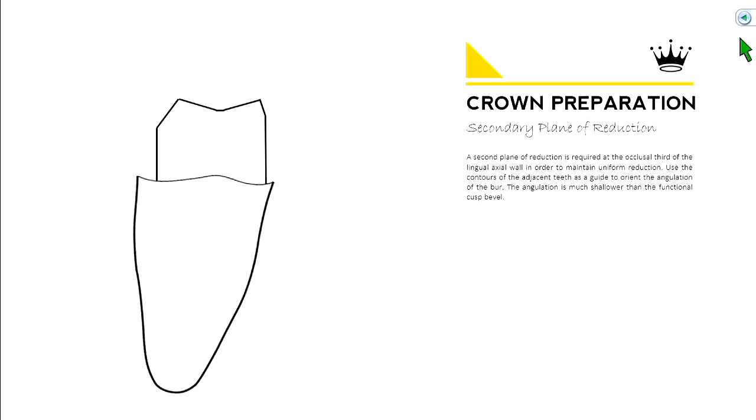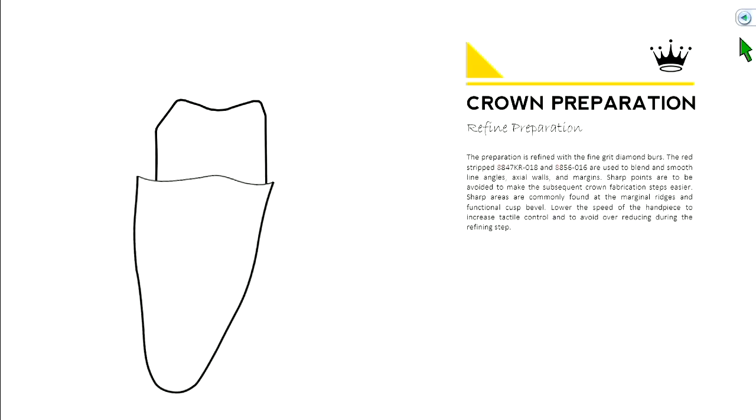That's the general outline of the prep. You'll see all the sharp angles and points — we're going to refine and smooth those out. We don't want anything sharp in our preparation. At the end of the day, that's what a crown prep should look like.